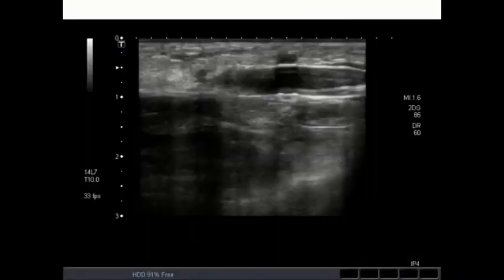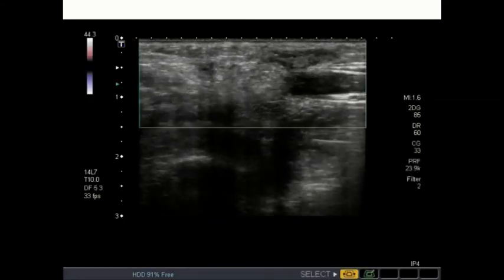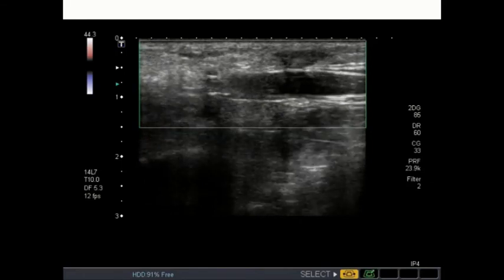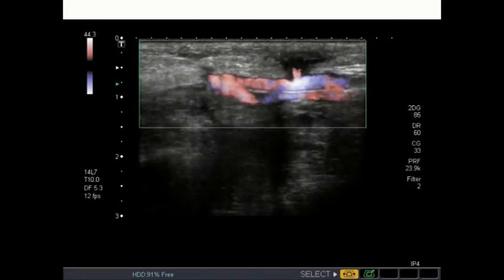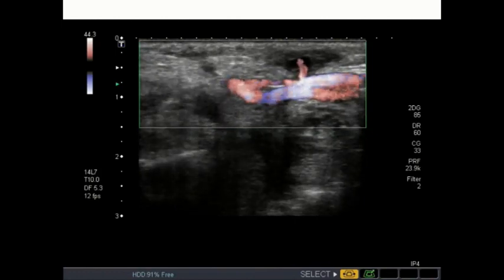Vessel rupture. Sometimes vessel rupture occurs. This is a rupture point. After we can see the deflation of the balloon at the rupture point, we immediately inflate the balloon and stop the rupture.